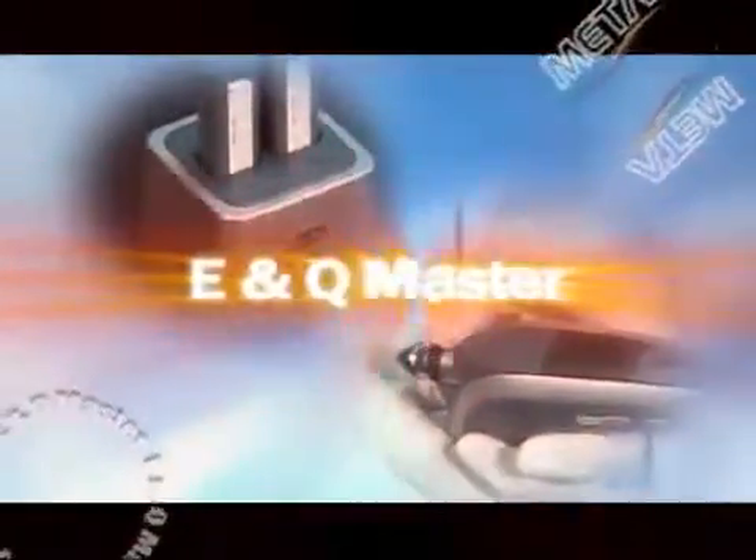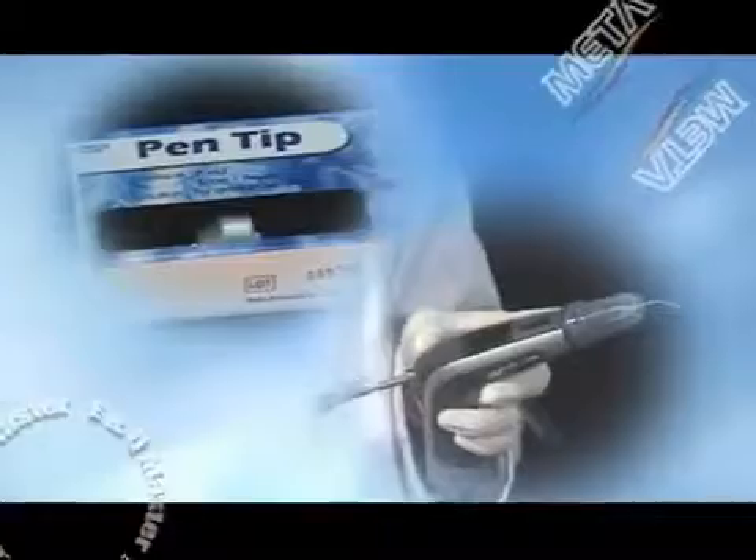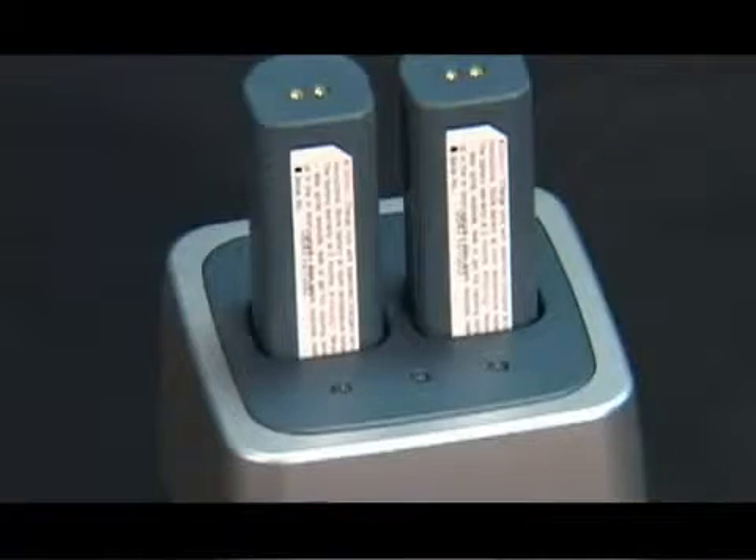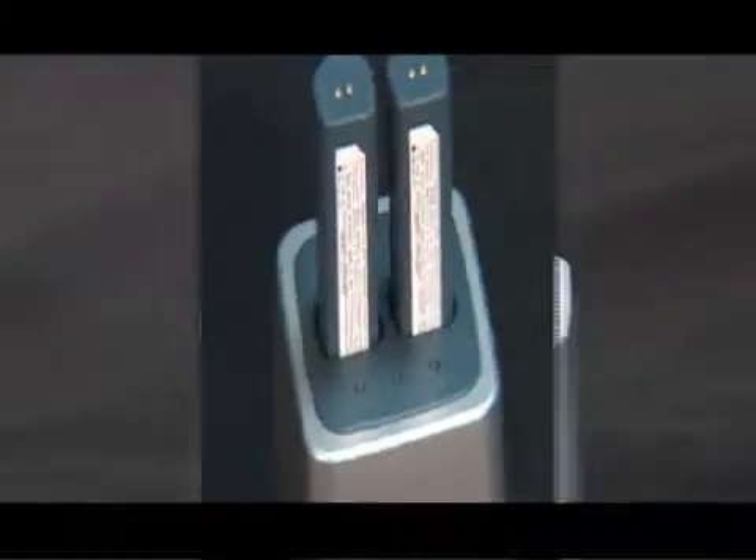MetaBioMed developed the world's first battery-removable cordless Gutta-Percha obturation system: the E&Q Master. This product was verified by dental specialists. These are the featured advantages of E&Q Master. It is convenient to use with a cordless battery charge method, similar to that of cellular phones.